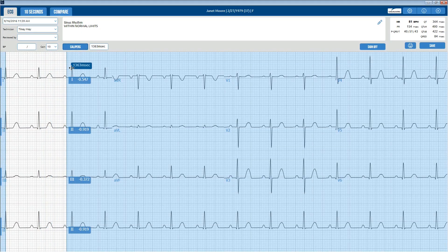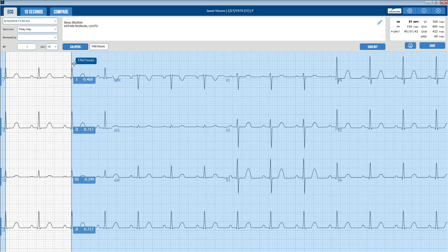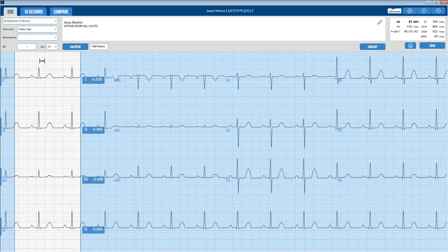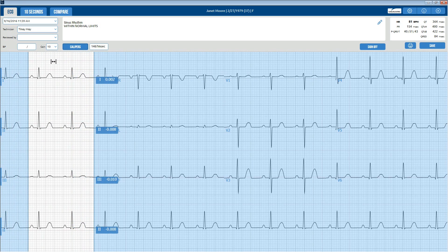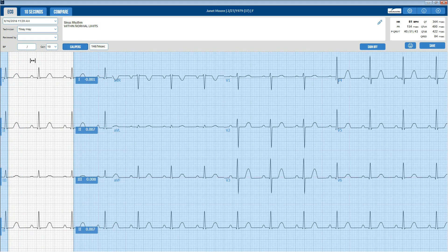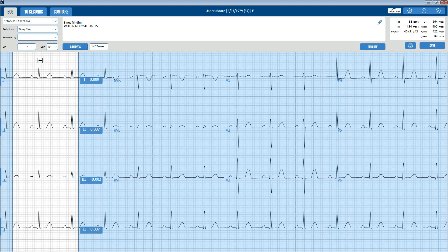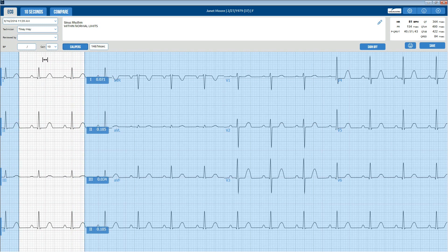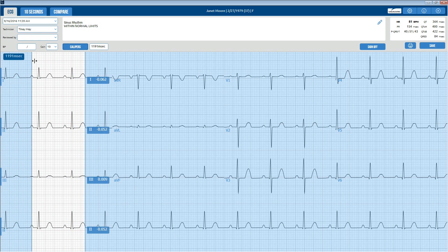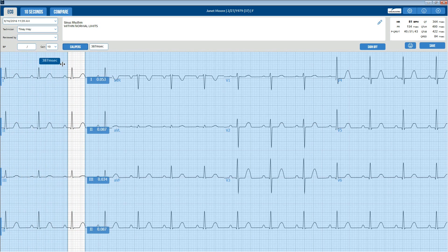Clicking and dragging on a specific caliper will move only that one caliper. Clicking and dragging in the middle of the calipers will move both calipers together. Calipers can be adjusted for a different duration of time by clicking and moving the right or left caliper.